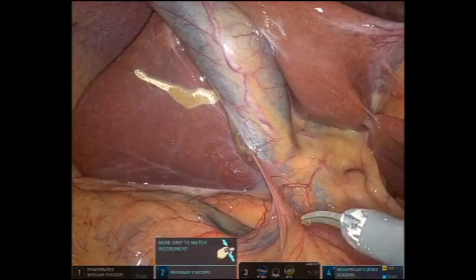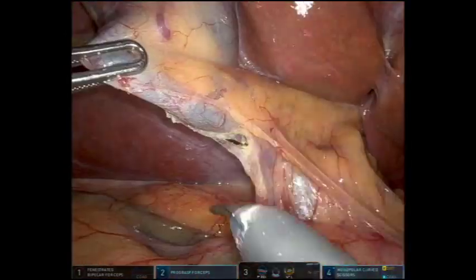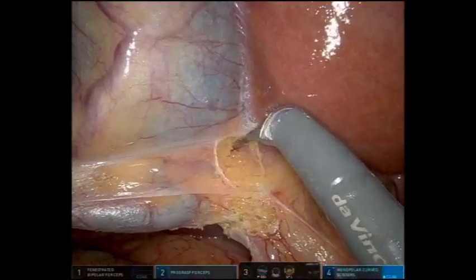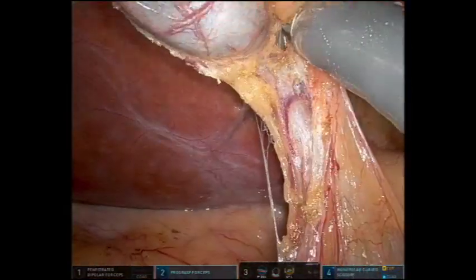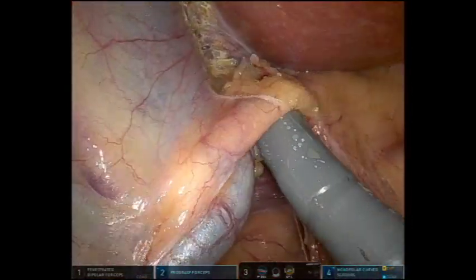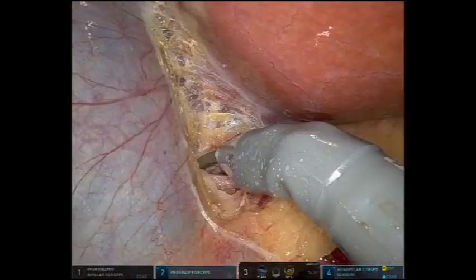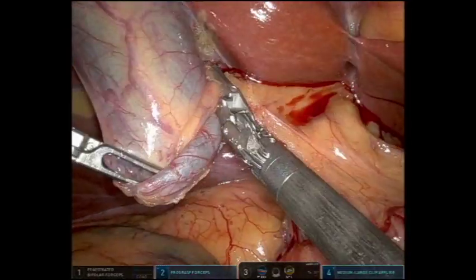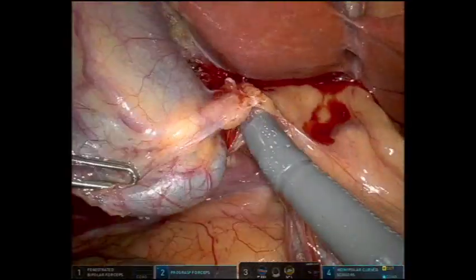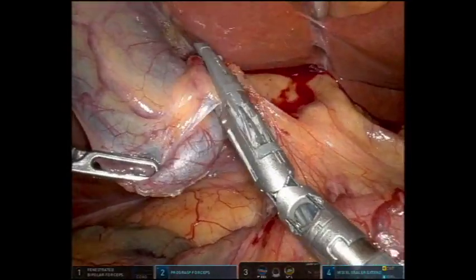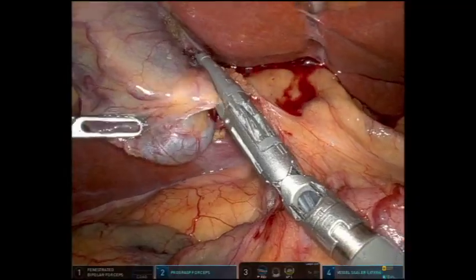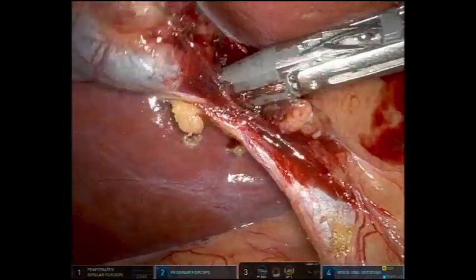The ultrasound probe had been used to mark out a margin around the tumor. The critical view was obtained by dissecting out the cystic duct and artery. Clips were placed on the artery and it was ligated with a vessel sealer.